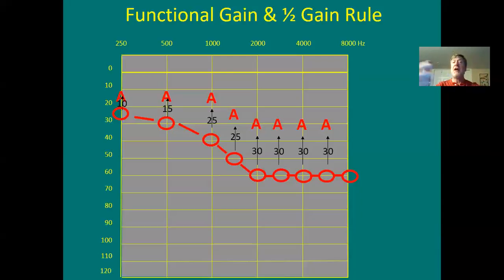You'd put him in the sound field. He would sit a meter away from a speaker. So you had the headphones off now. Now he's facing a loudspeaker, about a yard away from his face. And you, the clinician, are now playing warble tones at 250, then at 500. Why warble? You get less reverberation that way than with a pure tone.